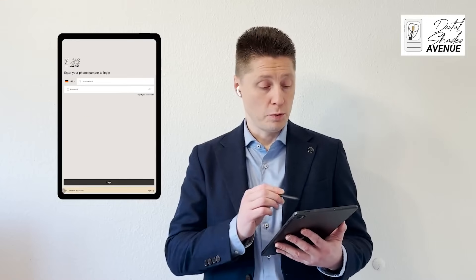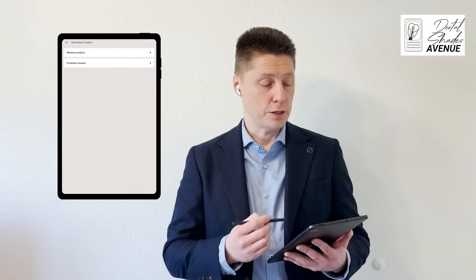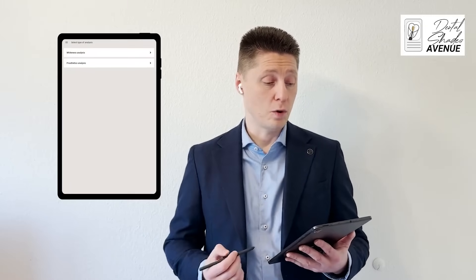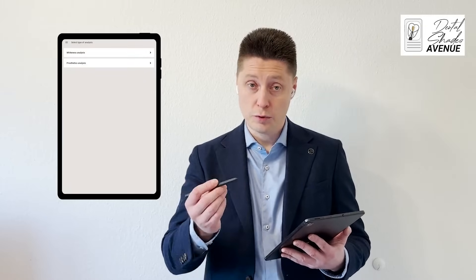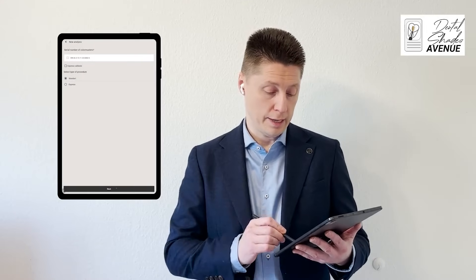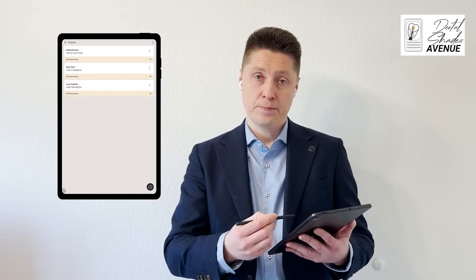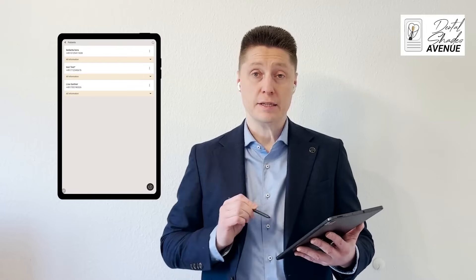So for that we will select the application, we will log in and we have two options. The first one is the whitening analysis and the second one is the prosthetic analysis. We will do that together. We will select this option, click next, and we can select the patient — in this case, Lisa Gardner.